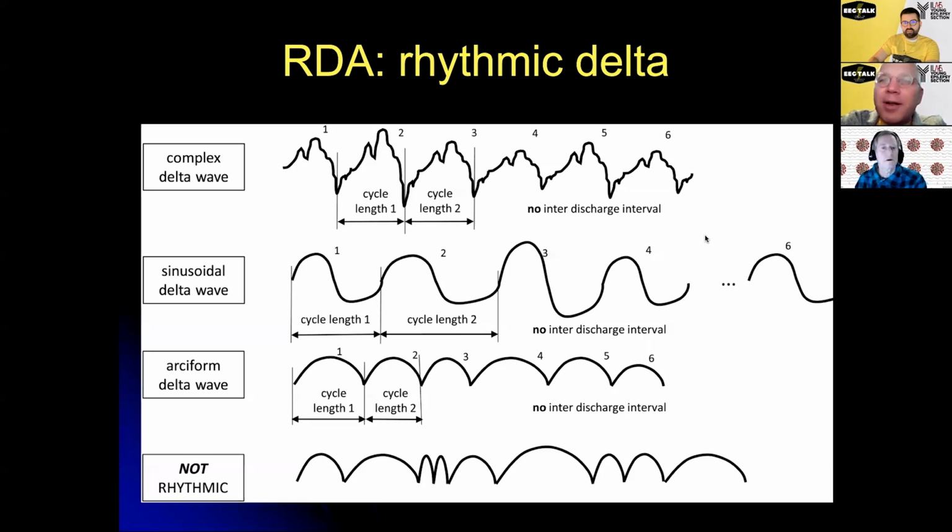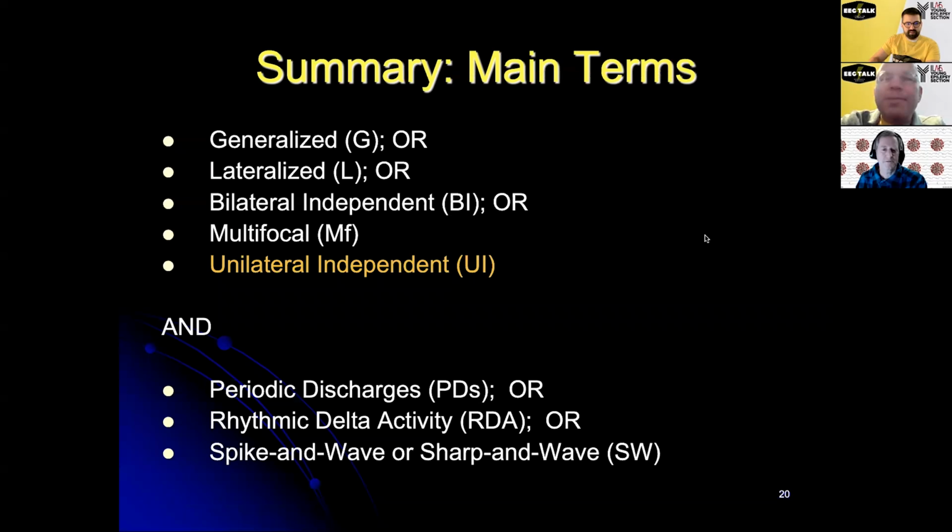Oh, that's just your nice summaries. That's really it. That's like most of the terminology. Nice and simple, right? Here we go. So we have some real examples. In real life, then, Dr. Hirsch, you usually start with main term one, and then you try to see if it's generalized, if it's lateralized, and so forth. And then you try to tease out main term two, and then you go forward.